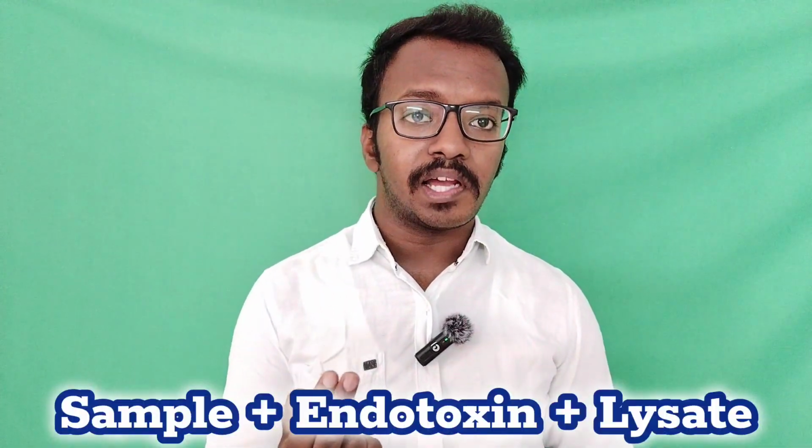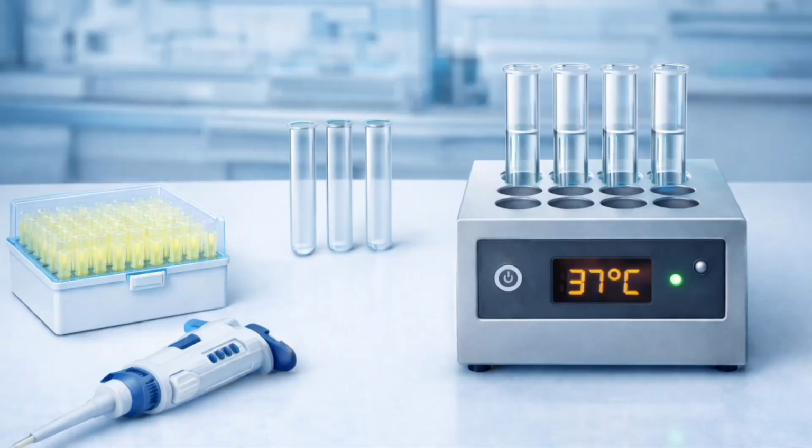Determination of NID mainly focuses on the product positive control. Now we have prepared all the sample tubes. They contain endotoxin, sample and lysate. This is a product positive control tube. After completion of sample preparation, all tubes are kept at 37 degrees Celsius for 1 hour. After 1 hour, the result is observed.